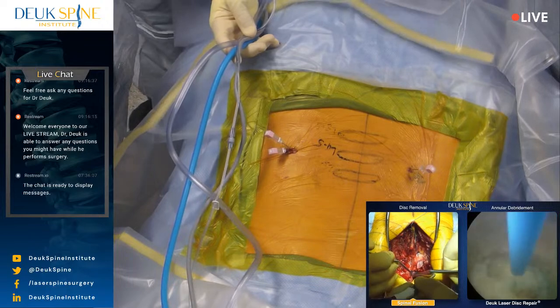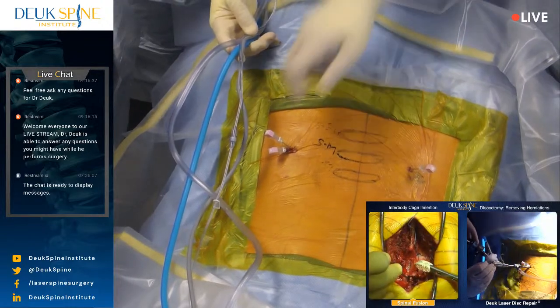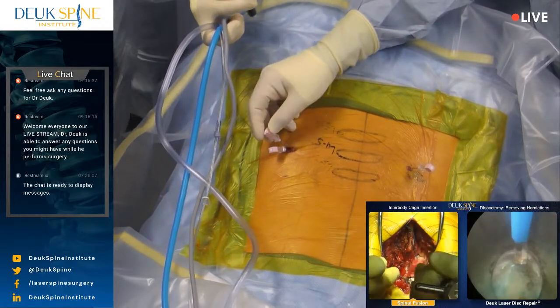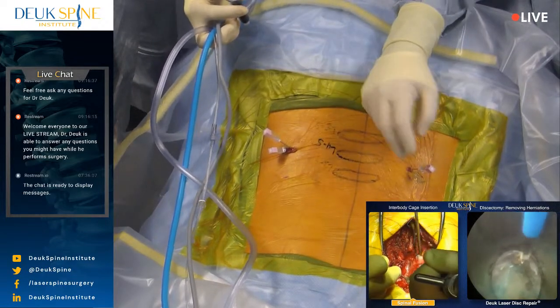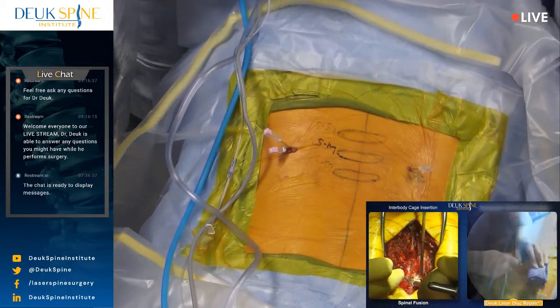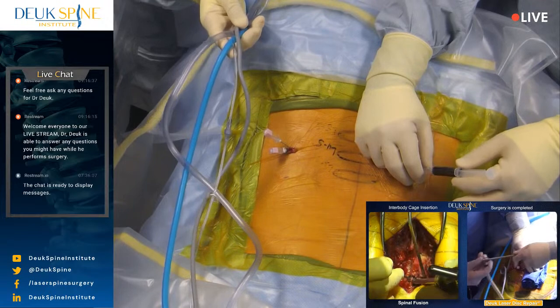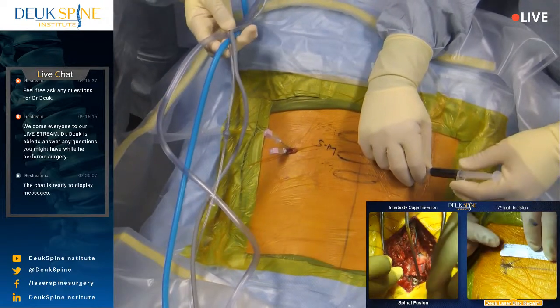After the fusion patient's damaged discs are removed, a metal or plastic cage housing bone grafting material is inserted in place of the removed discs. Once the laser has removed the painful part of the annular tear, the endoscope and tubular retractor are removed, leaving less than a half inch incision in the skin.